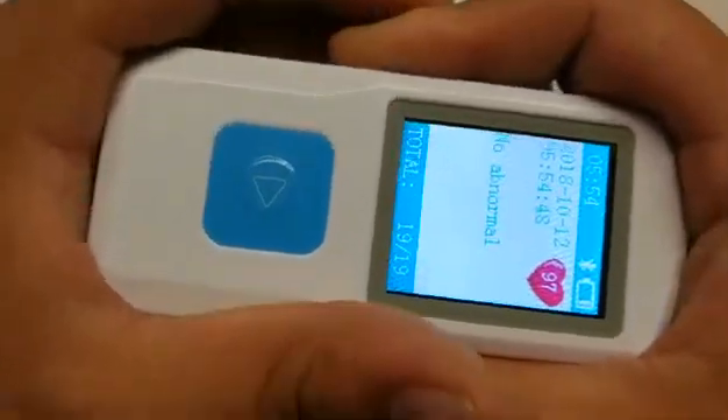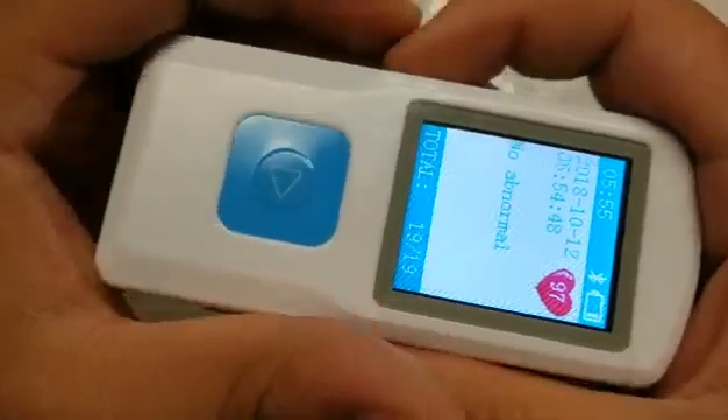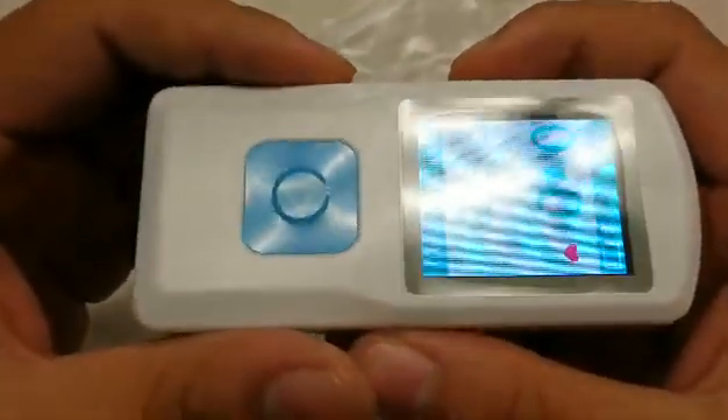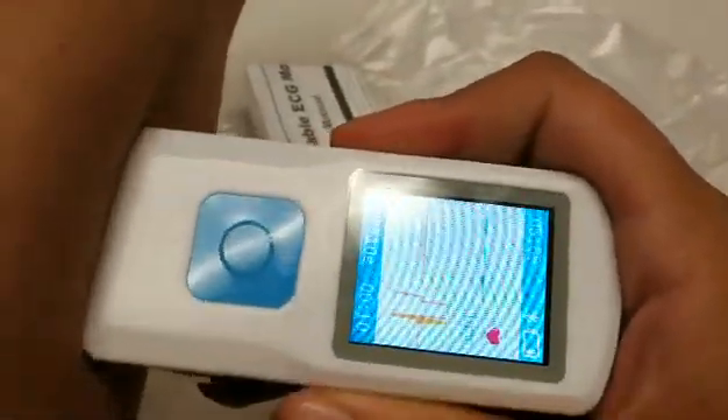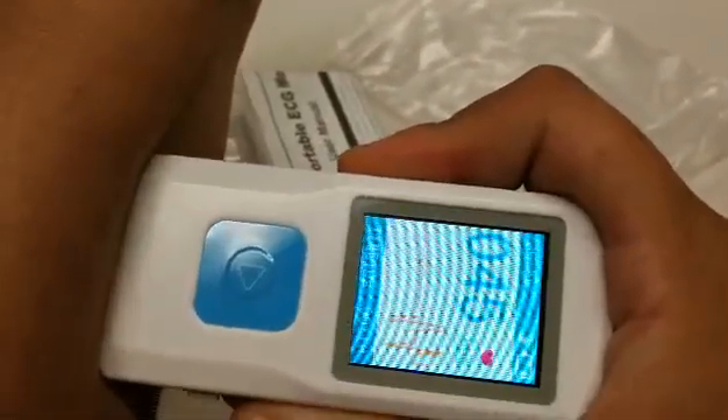At the end of this, you will get a summary of any symptoms encountered. Another way to get a reading is as such, again holding onto the metal leads as tight as possible.